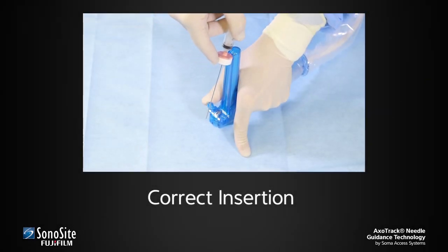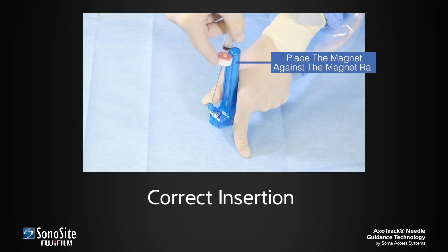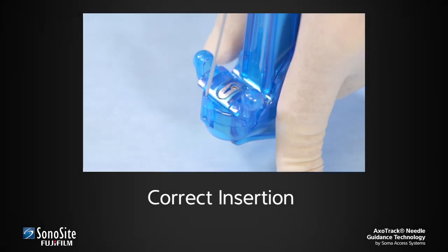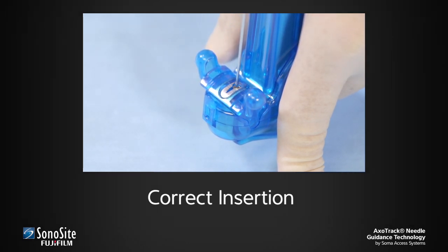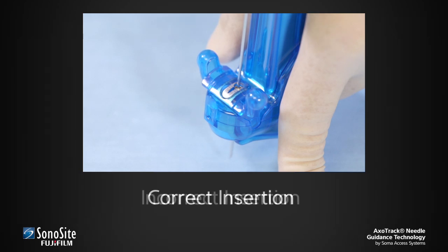Gently pull on the sleeve until the elastic band is snug against the flange of the transducer shield assembly. Insertion of the needle into the needle guide is facilitated by resting the magnet on the magnet rail. Place the magnet against the magnet rail to stabilize the needle assembly. Align the needle tip with the needle guide orifice and advance the needle into the guide.